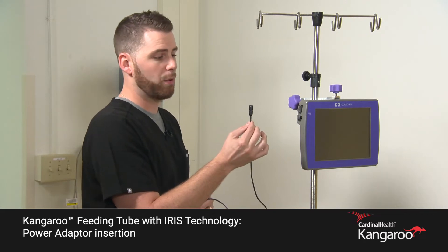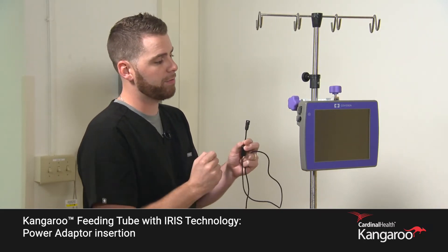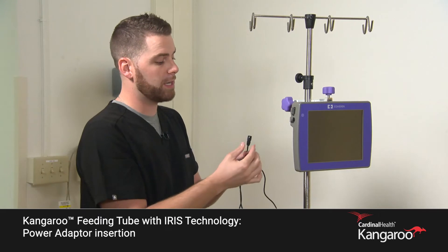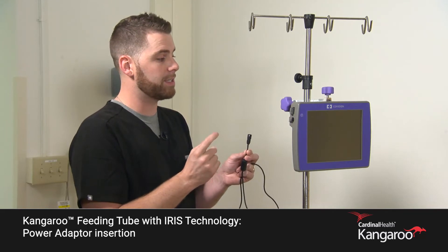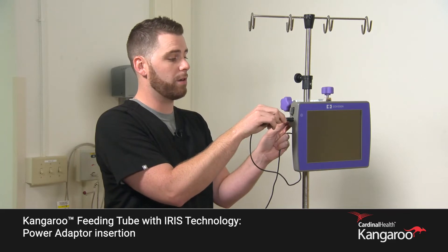It's important to note that to connect your power, you want the white arrow on the front of the power connection facing the front screen of the console. The power adapter does have a sleeve — it will connect and sit itself in place. To insert, align the white arrow forward.